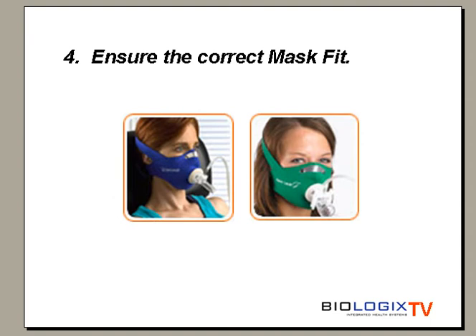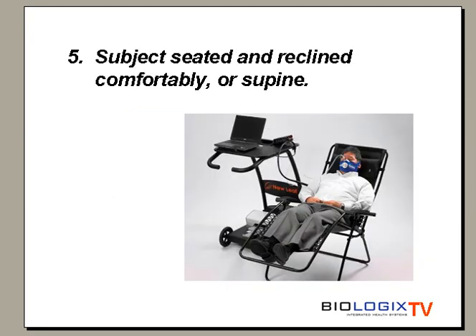Point 5, make sure the client is seated comfortably, like in this photo on a zero-gravity recliner, or, as earlier stated, supine or lying down. If seated, we want to ensure the shoulders are back and that the muscles used in respiration are not restricted in any manner.